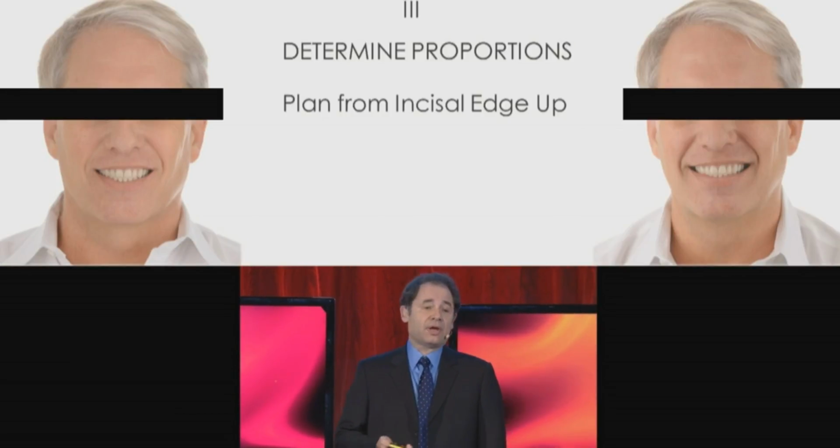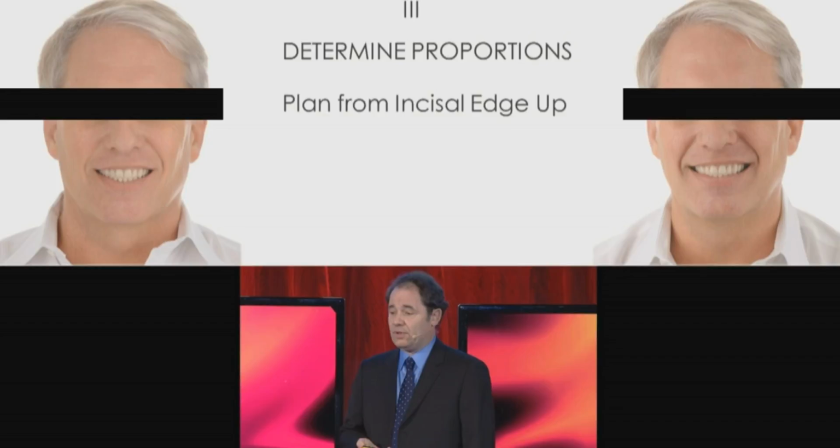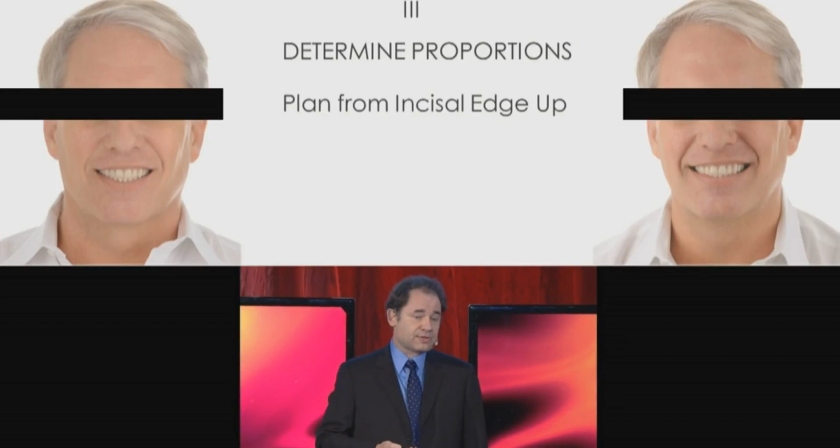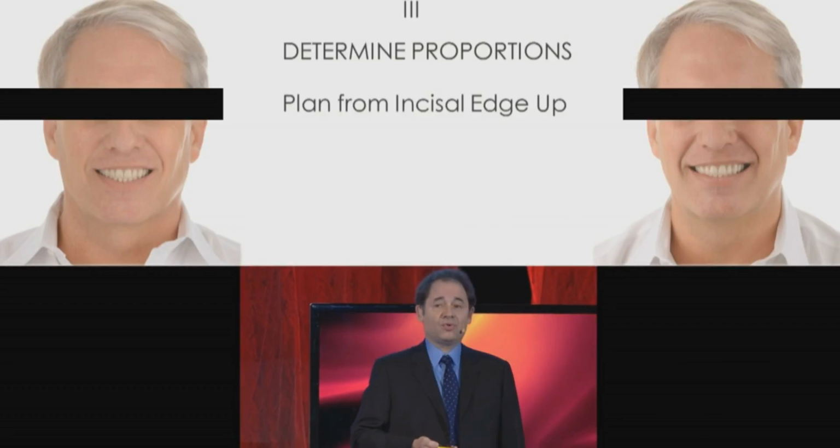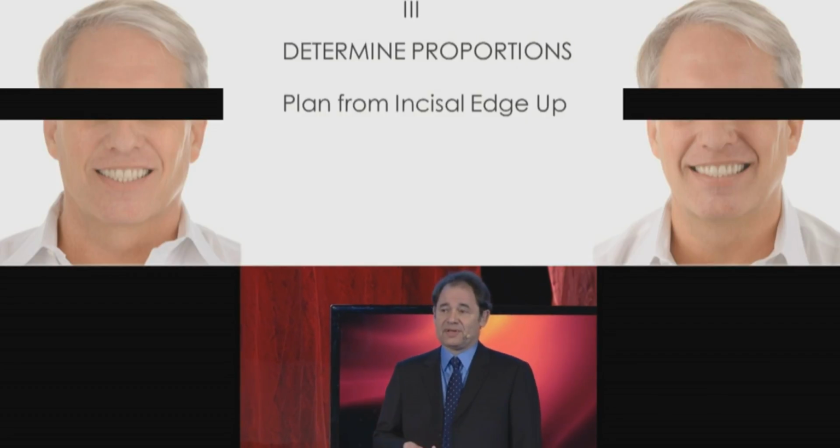Now, we're going to look at number 3. You need to determine your proportions. And at some point in this reconstruction, we are going to plan from the incisal edge up.